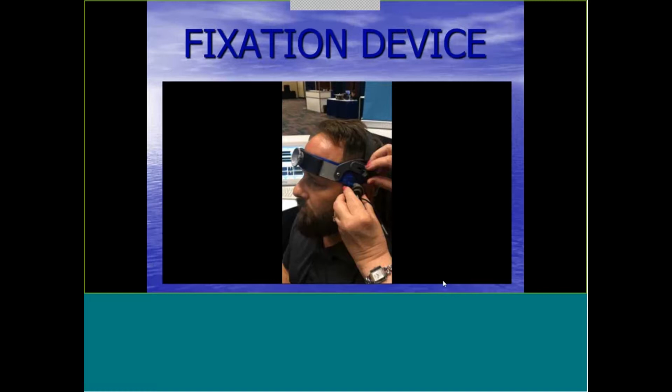I'm going to loosen this up a little bit while I find the signal.